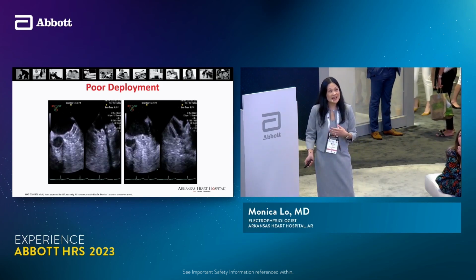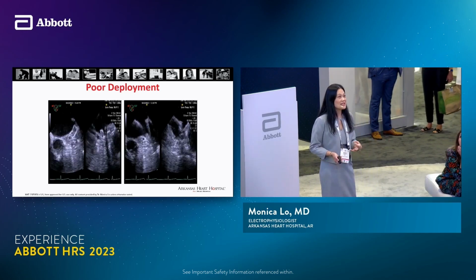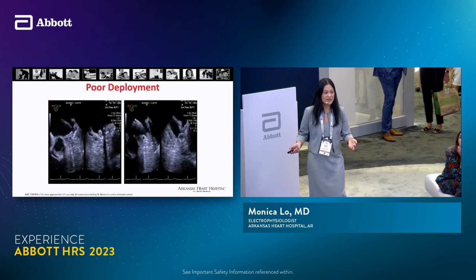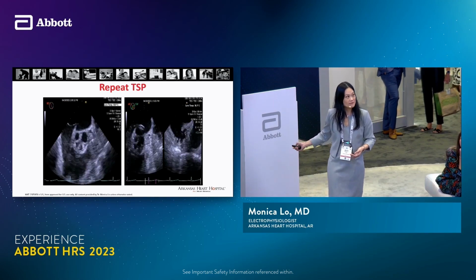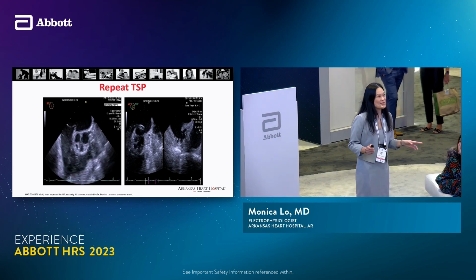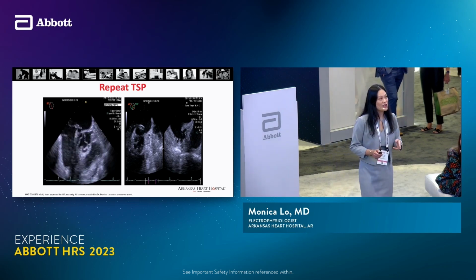So we tried different sizes. I went into different smaller lobes to try to see if it'll sit. But ultimately, it was decided that I need to re-puncture, even though you saw that jump rope of that interatrial septum. And this, right, kind of takes pause. So when you say anterior, right, it's anterior to your comfort level.